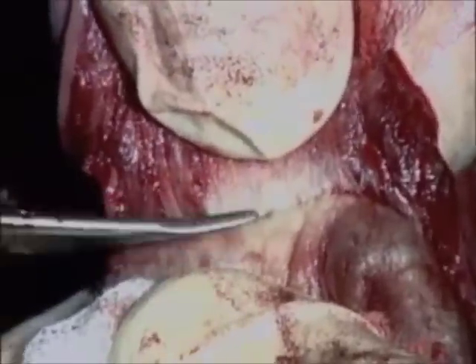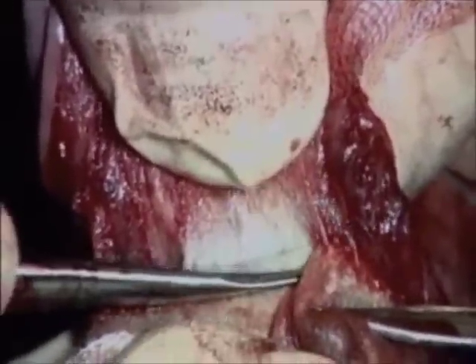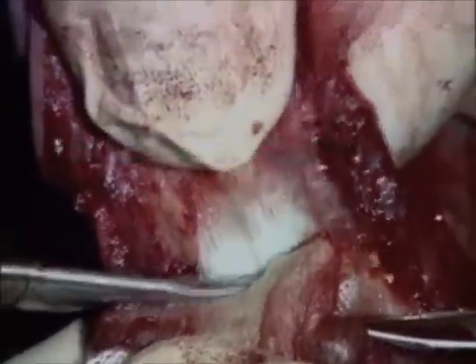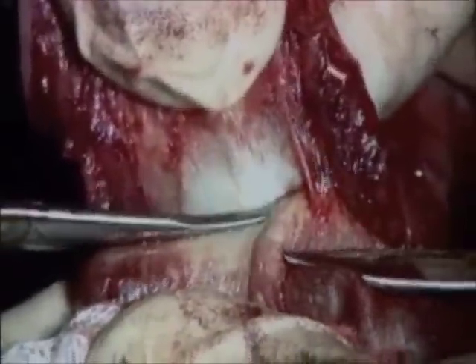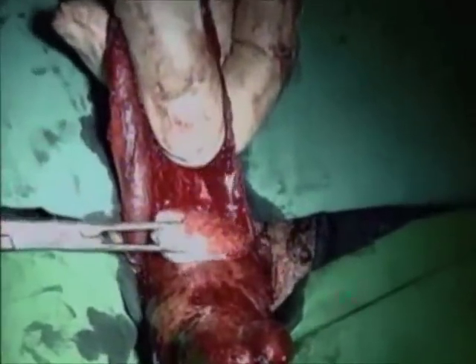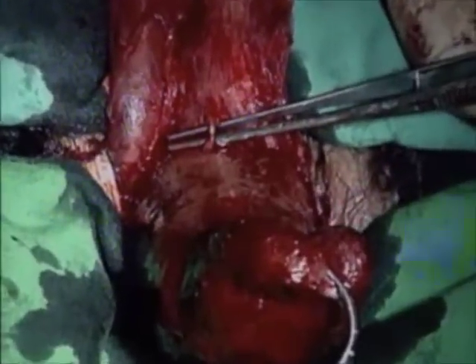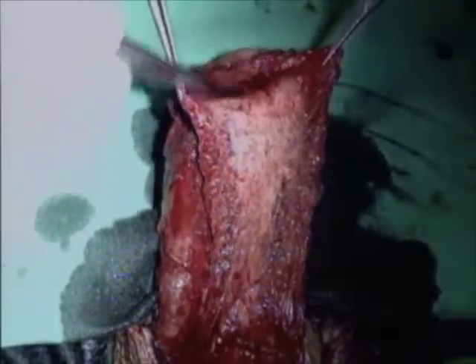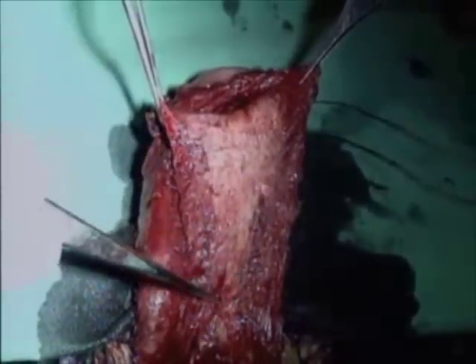A portion of the plaque remains attached to the neurovascular bundle, the other portion being within the tunica albuginea. Dissection is completed at a site where a perforant artery is located. This procedure enables complete preservation of all structures of the neurovascular bundle and the thinning of the plaque within the tunica albuginea. The corporal bodies are completely separated from the neurovascular bundle and the urethra using the penile disassembly technique.